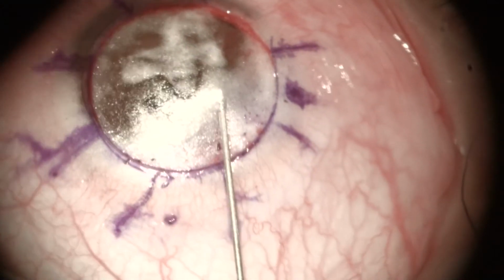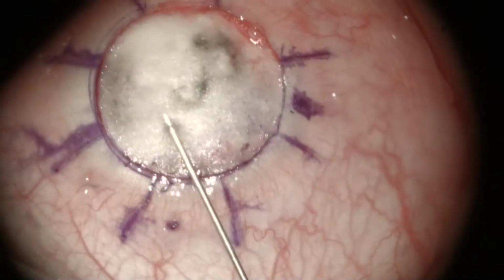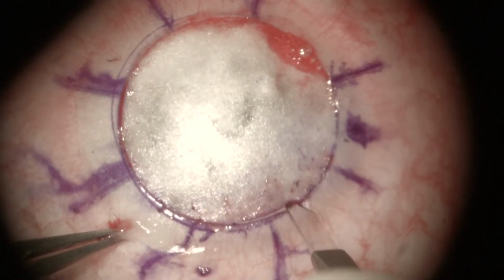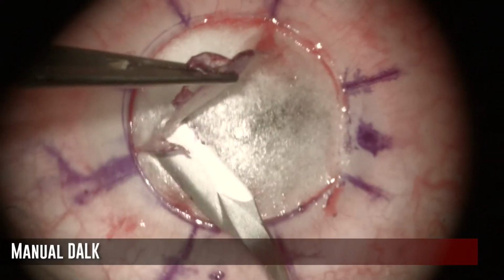This is a typical case where we can't create the bubble. Transillumination indicates the absence of the bubble. So when we can't create a big bubble, what we recommend is to continue with an air injection and keratectomy sequence until we run out of space in the stromal bed to place the needle without puncturing into the anterior chamber. This is called manual DALK.